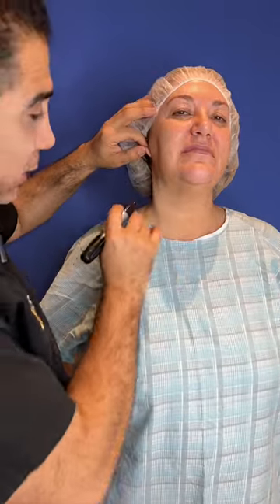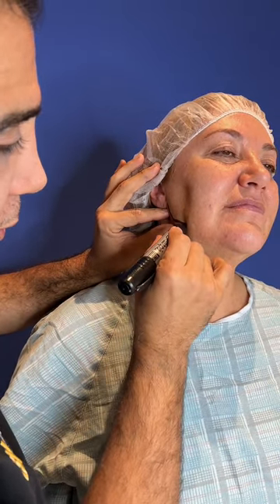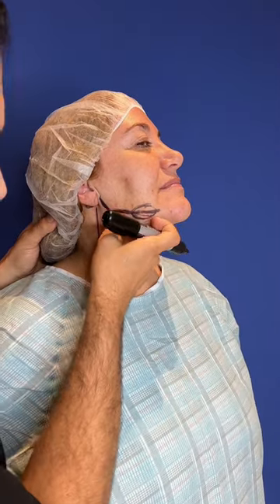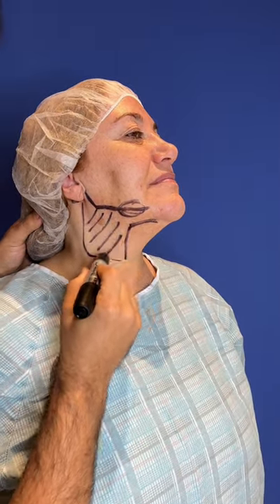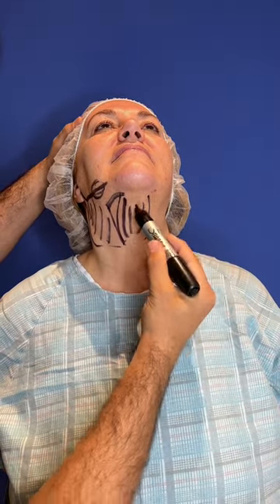We're going to do lipo contouring of the neck area — no incision, just a little hole hidden behind the ear. I'm also going to go down and chisel her jawbone. The main area we're going to attack is this — we're going to give her a nice L-shaped jawline. We're going to take all this out right here and concentrate in this middle area.